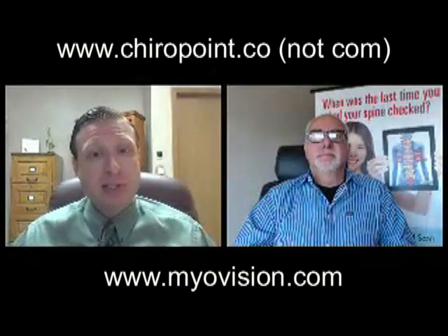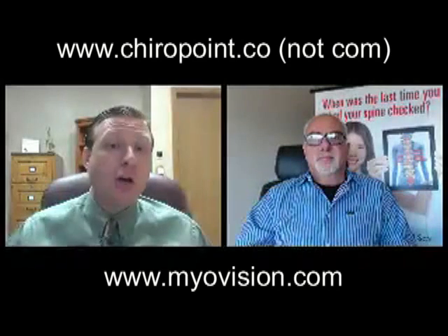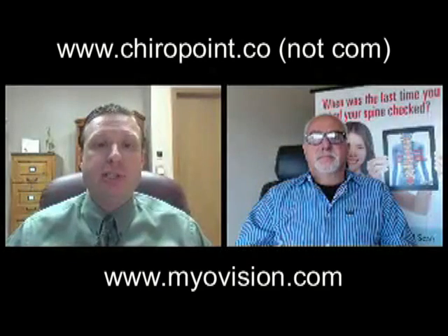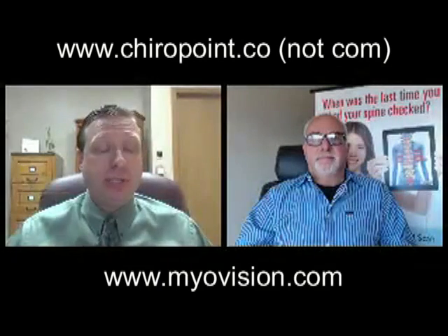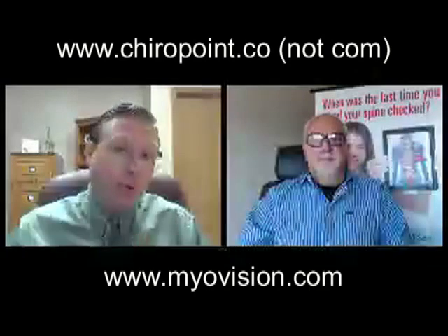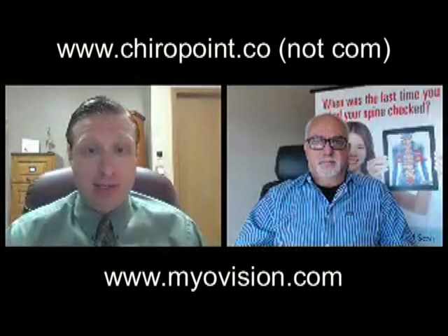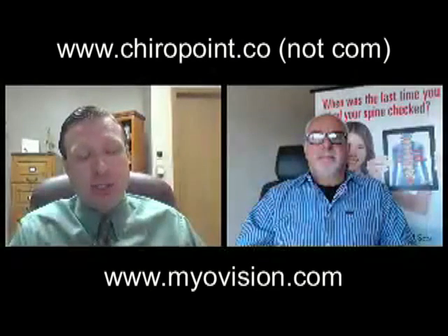Now, in our office, Dr. Susan, my wife and partner, and I feel really strongly that it's also great to do progress exams. About every 12 to 14 visits, we will do a progress exam with a new MyoVision scan. And that enables us to say, okay, Sally, here was your initial exam. Now here's the progress exam that can show what's new, what's different, where we focus our attention next, and what's better. It does two different things.